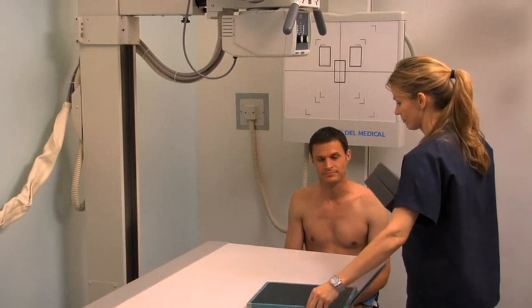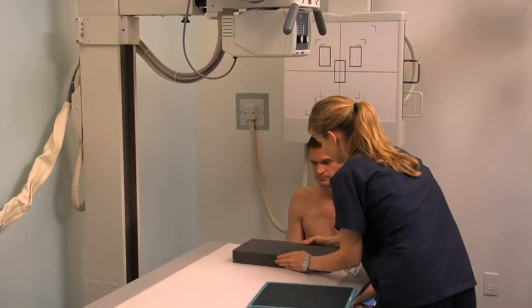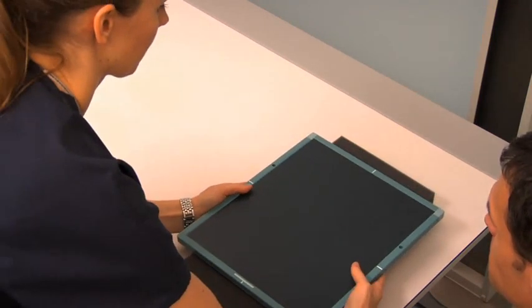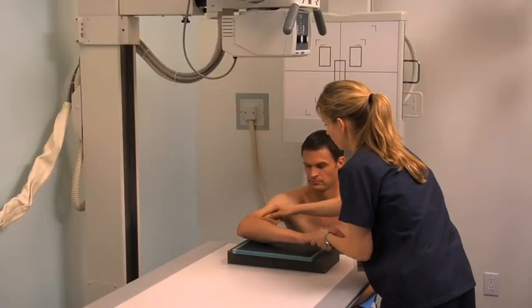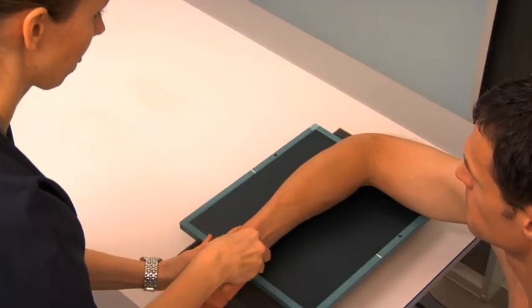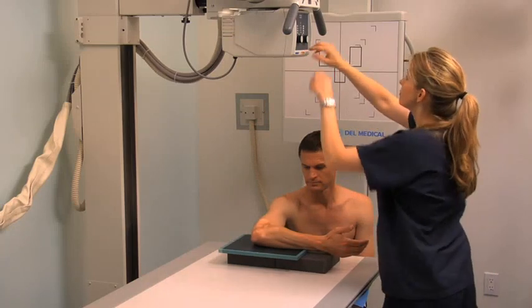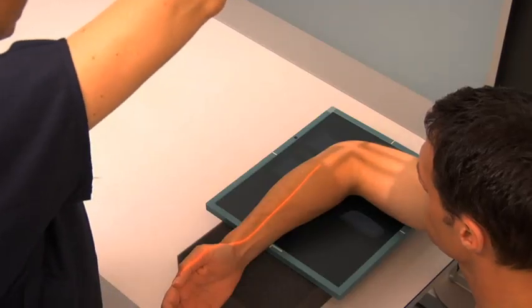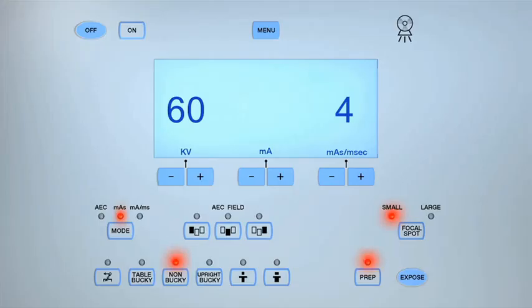For a lateral elbow projection, place a second 10-by-12-inch cassette on the tabletop. Radiolucent sponges can be used to elevate the cassette to enable the patient to place their forearm, elbow, and lower humerus at the same level on the cassette. Assist the patient to place their arm on the cassette, flexing their elbow 90 degrees and aligning it with the center of the cassette. Rotate their hand and wrist into the lateral position. Center the central ray to the midpoint of the elbow joint. Collimate the light field the same as for the AP projection and expose the cassette.